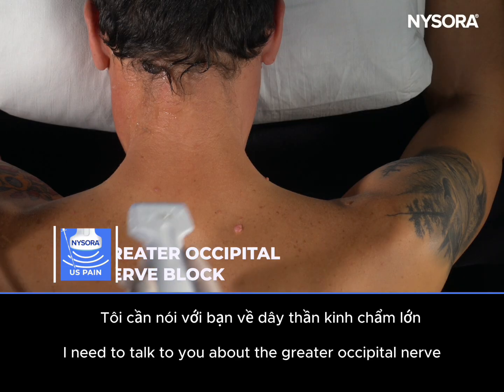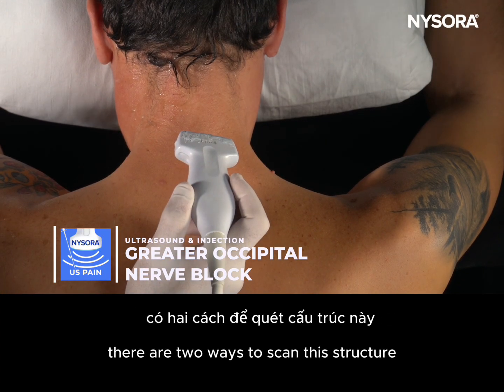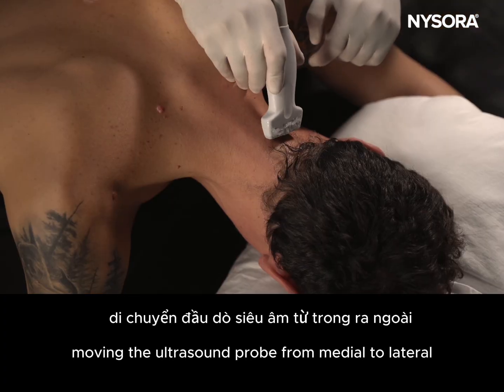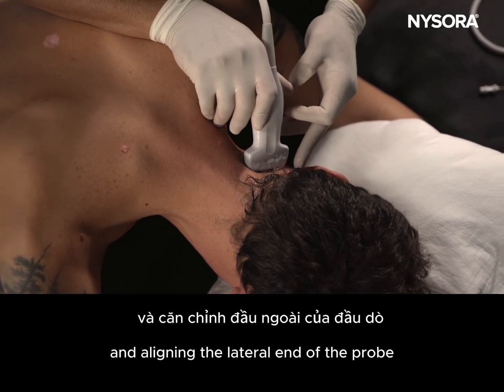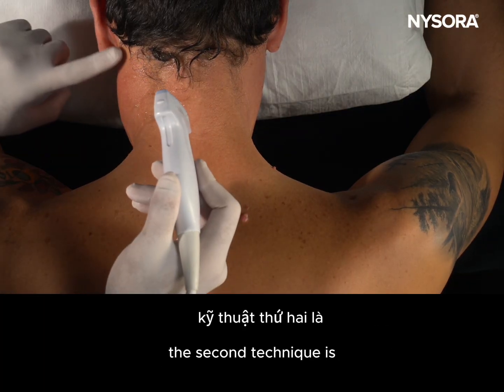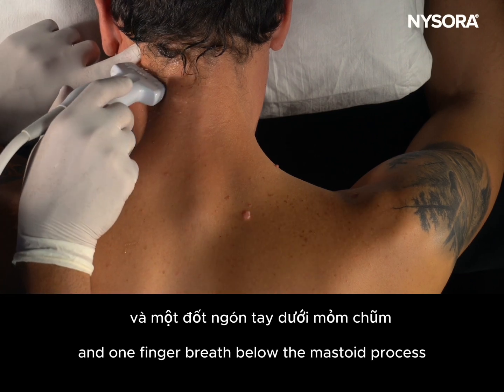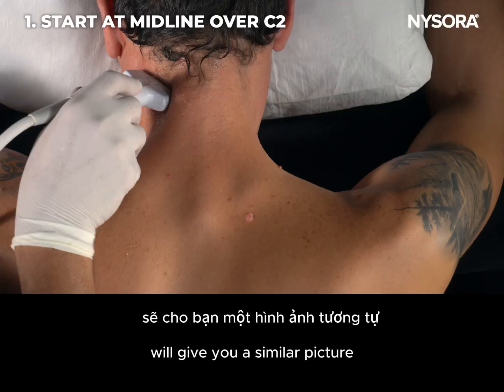I'm going to talk to you about the greater occipital nerve block with ultrasound guidance. There are two ways to scan the structure. One would be the midline technique to scan for the C2, moving the ultrasound probe from medial to lateral and aligning the lateral edge of the probe just 1 finger breadth below the mastoid process. The second technique is starting with the mastoid process: feel for the mastoid process, and 1 finger breadth below the mastoid process, if you align the lateral end of the probe, it will give you a similar picture.